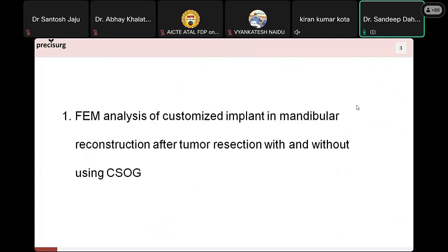In this particular radiograph, specifically, we have taken the dimensions of the head of the bone, then the neck region, the isthmus, the radius. Isthmus means the narrowest portion of the bone, and the length of the bone. So here two bones are fractured, the metatarsal and the phalange. So these are the dimensions for the metatarsal bone, and we also took the dimensions for the phalangeal bone. Based on this data, we finalized the dimensions for the implants.